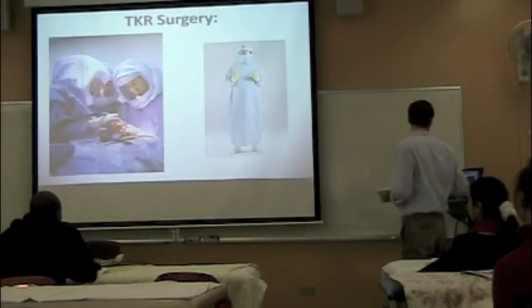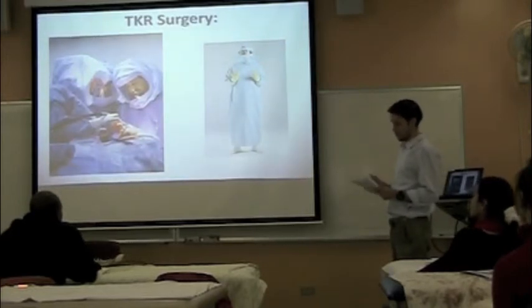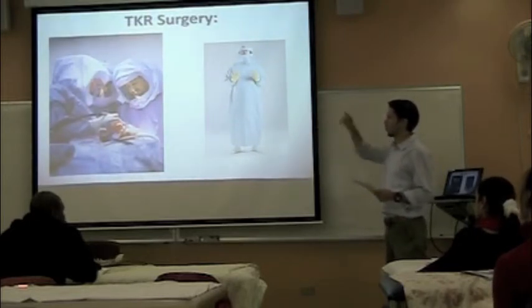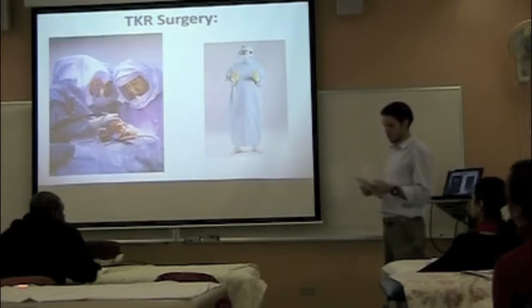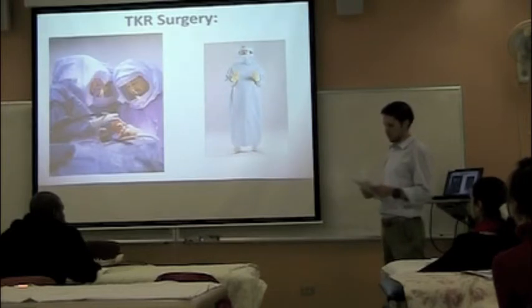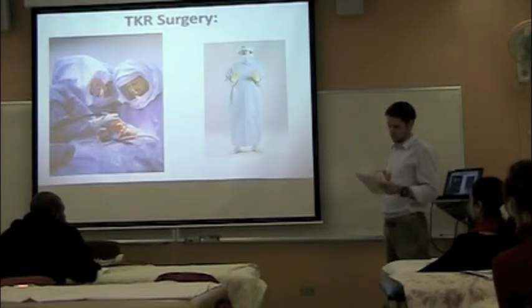As far as the surgery goes, it's pretty involved, it's pretty complex. It normally takes about 1 to 2 hours. The patient is given antibiotics and wrapped entirely in a sterile sheet. All the surgeons and the medical assistants are also fully encased in a medical spacesuit almost, with an oxygenated helmet to keep that unit, because it's a single unit, cut off to limit the bacteria or any sort of infection, which could have serious detrimental effects on the surgery.